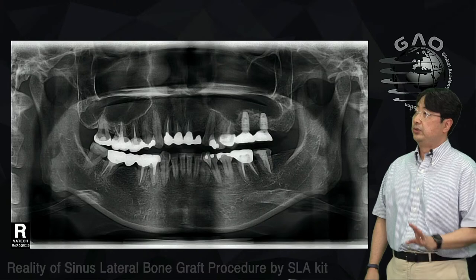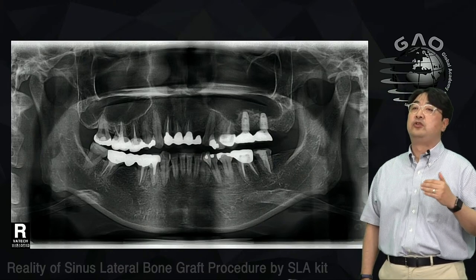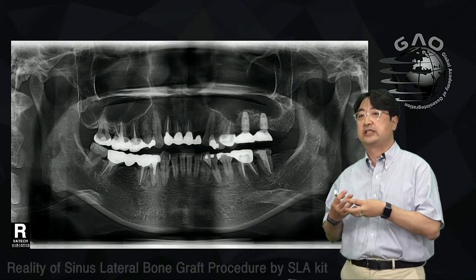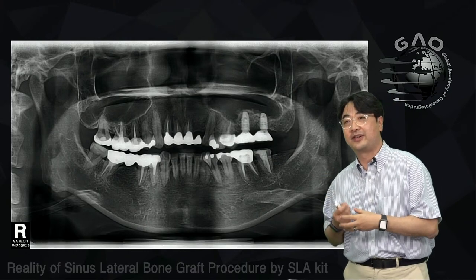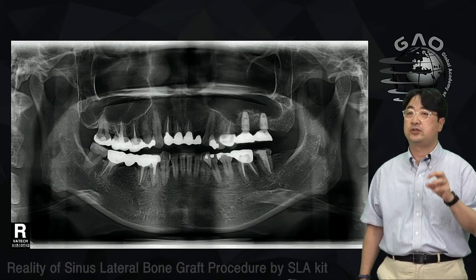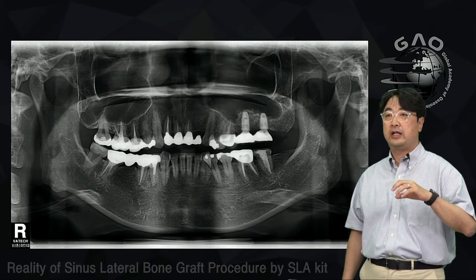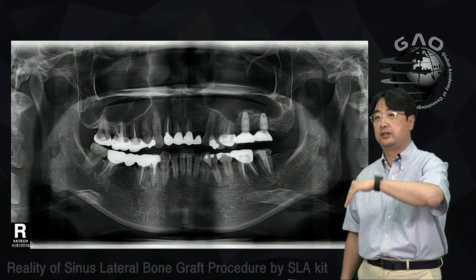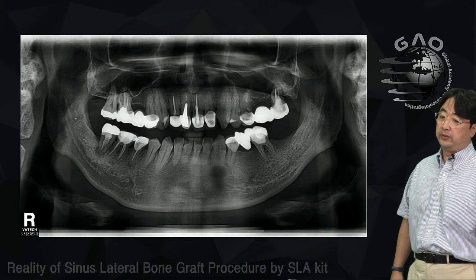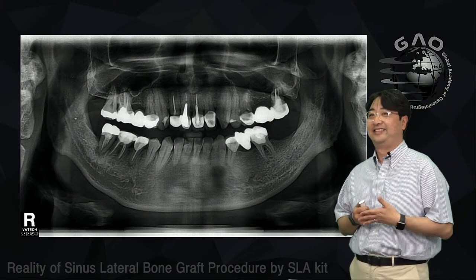Well, if you have a perforation, you have to consider it exposed and dissect, not from the crestal, because you have a crestal opening already, right? So in those cases, you can use the lateral approach to help dissect the membrane and the crestal tearing of the crestal area.